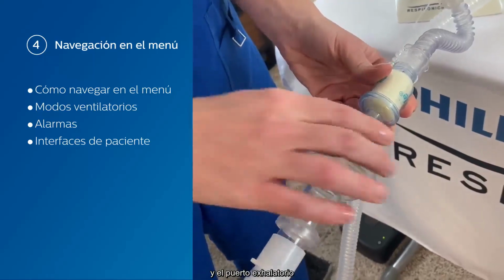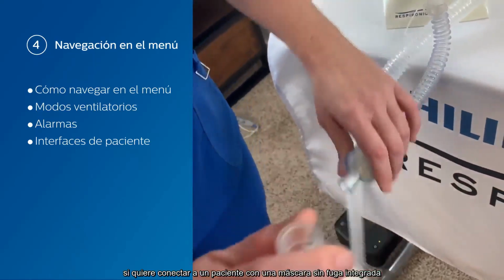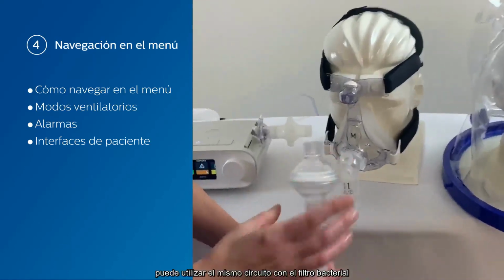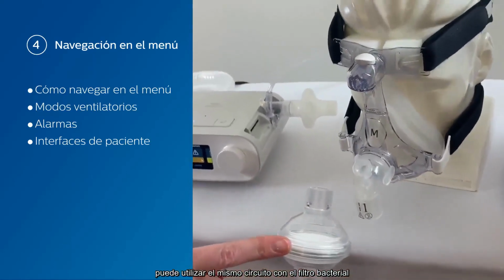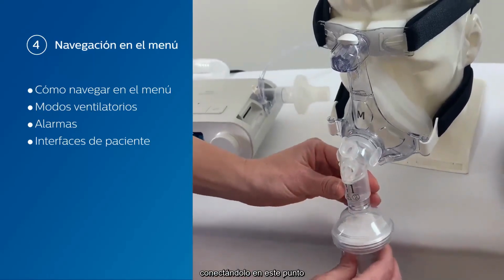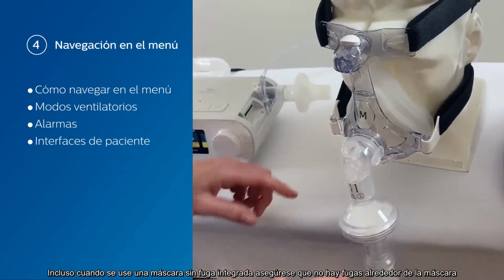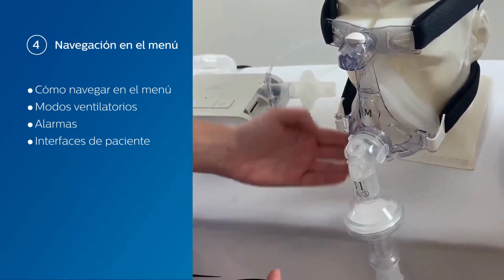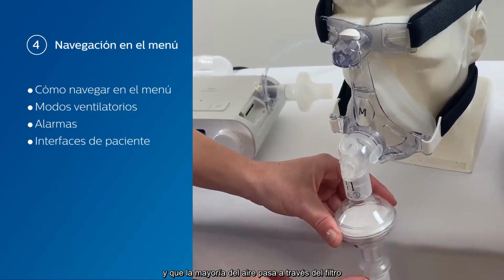and our exhalation port. If we want to connect to a patient with a non-vented mask, you can use the same circuit with the bacterial viral filter and exhalation port and your tubing. You would connect right here. Even when using a non-vented mask, we want to make sure that there are no leaks around the mask and that the majority of the air is filtered through the filter here.